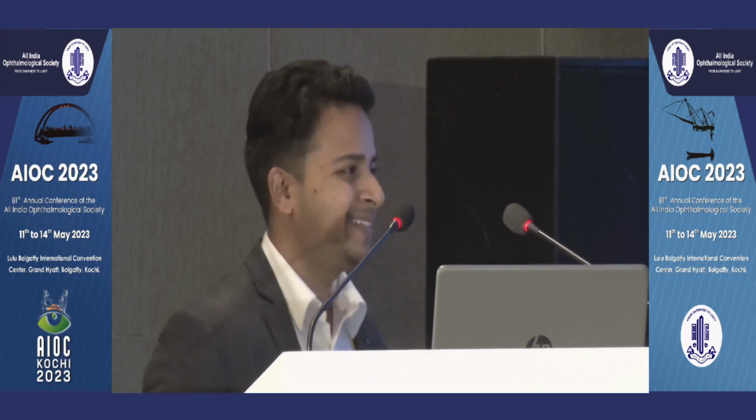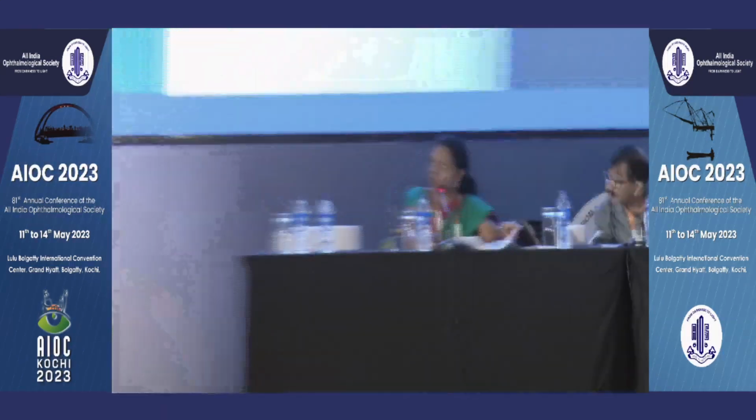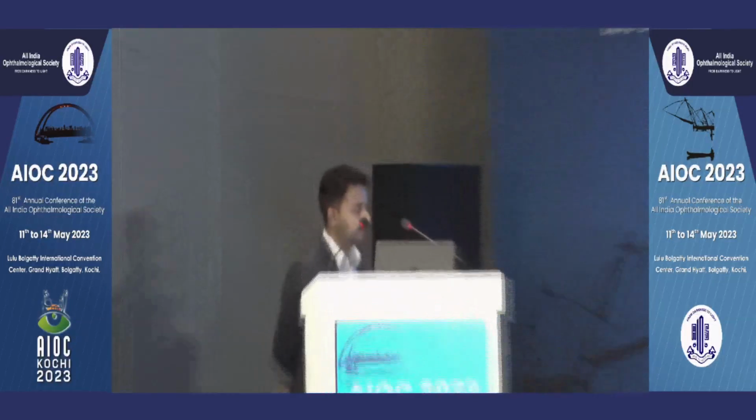Okay, thank you, Dr. Shivam. I have a question. Yes, ma'am. So what algorithm was used, the SITA standard or SITA fast or faster? Ma'am, SITA standard 24-2. SITA standard. Okay.